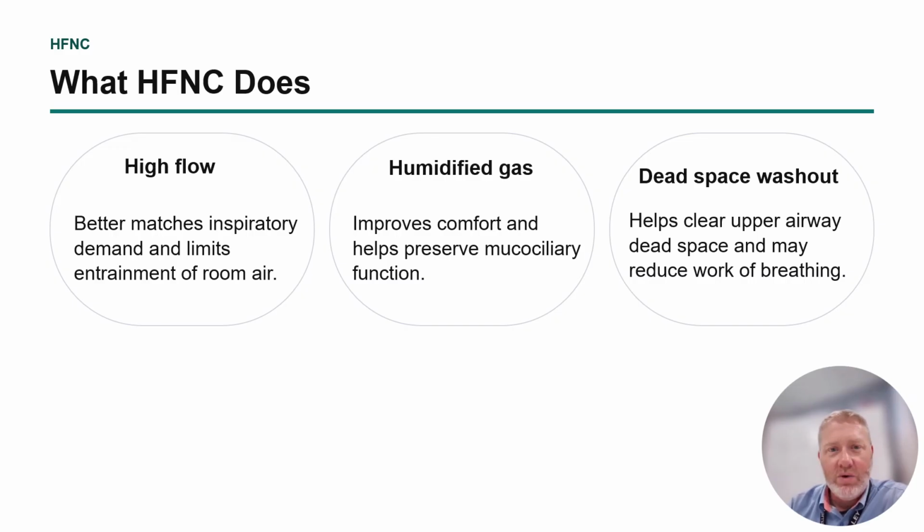What high flow technology does is, because it either meets or exceeds the patient's inspiratory demand, it takes the work of breathing off of the patient, at least a little bit. So in the peds population, especially your bronchiolitis RSV kids, they benefit greatly from high flow nasal cannula therapy, and you don't have to go too high on the flow.